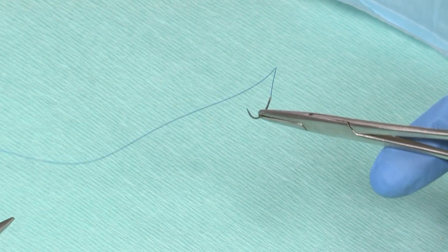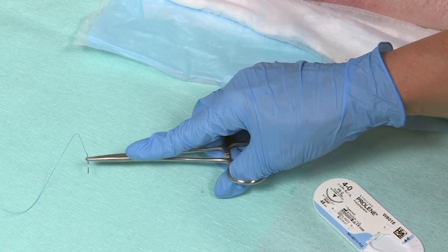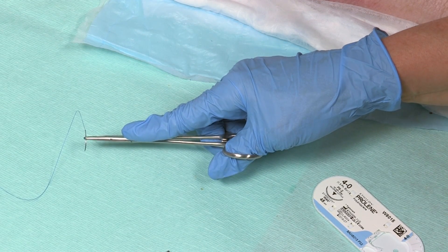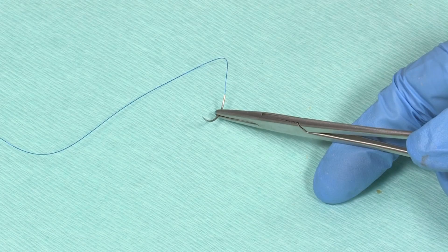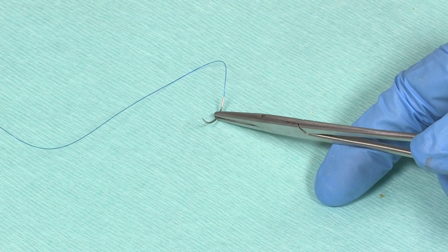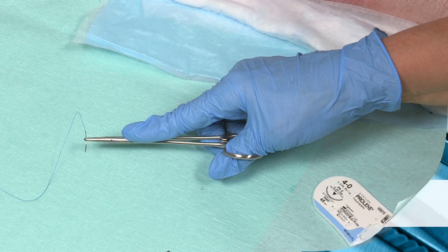Pick up the needle holder with your thumb and ring finger in the holes and the index finger pointing down the shank to eliminate tremor. When you close the needle holder you should hear a single click, so you know you're not putting too much pressure on the junction of the jaws of the needle holder, which damages this equipment. If you need to reposition the needle, for example to perform a backhanded suture, use your forceps to hold the needle while you adjust the position of the needle holder.